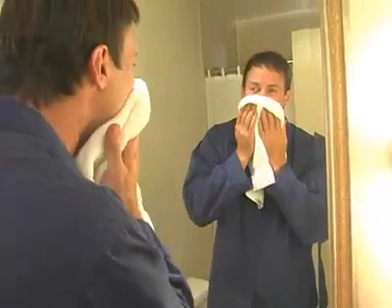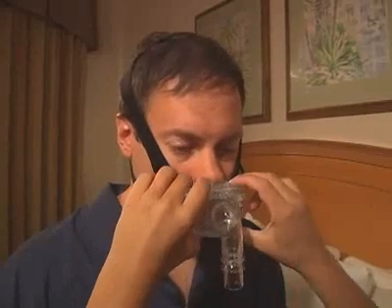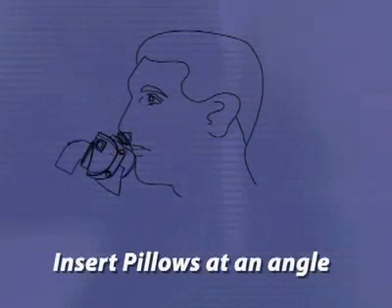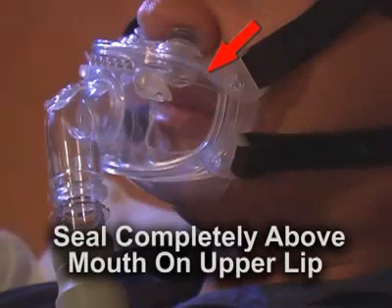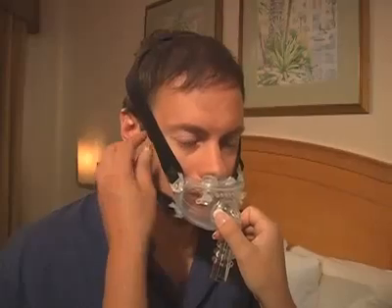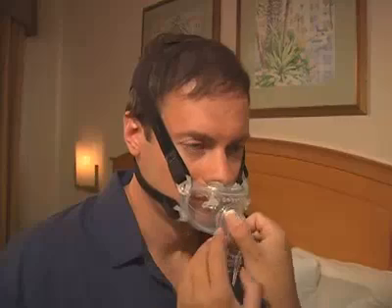For optimal fit, ensure that the patient's face is clean and dry before applying the hybrid interface. To fit the hybrid, pull the headgear back over the top of the head. Next, insert the pillows at an angle into the patient's nose and then rotate the oral cushion downward over the mouth. Note that the upper wall and seal of the cushion should sit completely above the mouth on the upper lip. Adjust the headgear's four side straps by gently pulling the Velcro tabs until the interface cushion fits comfortably on the face. Note that each strap should be adjusted to achieve an overall even and balanced pressure between the cushion and the face.